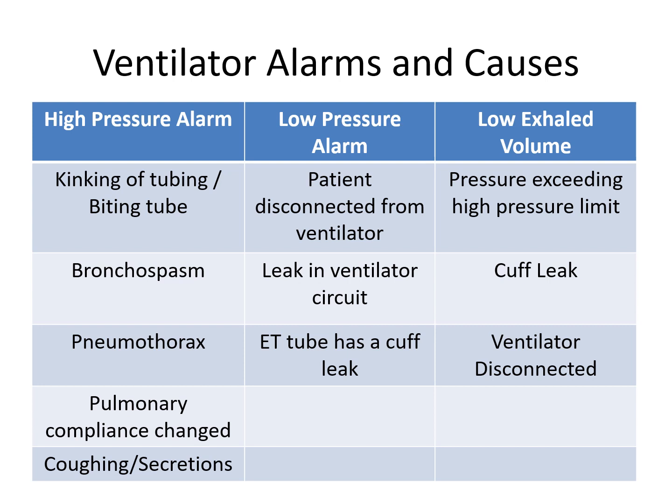Low exhale volume usually means the pressure is exceeding the high pressure limit, and it could be the cause, where you're losing volume somewhere, such as a cuff leak or the ventilator being disconnected. So those are causes for your ventilator alarms and why you would have them.